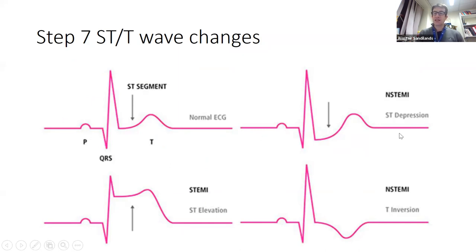What I try to say is that there's like a big piece of string pulling the ST segment down. So now we're below the isoelectric line. There's our isoelectric line here, and the ST segment is below. So it's depressed, beneath the line: ST depression, which you normally see in non-STEMIs.